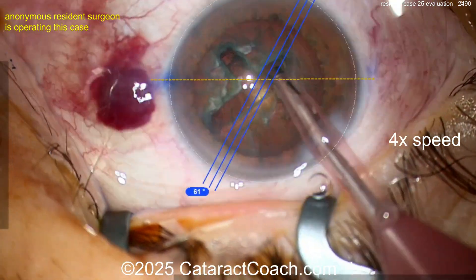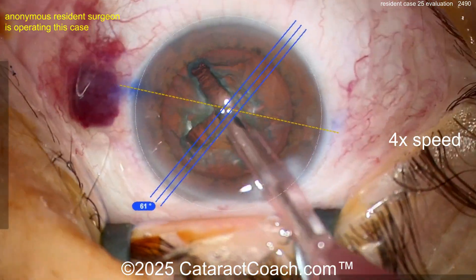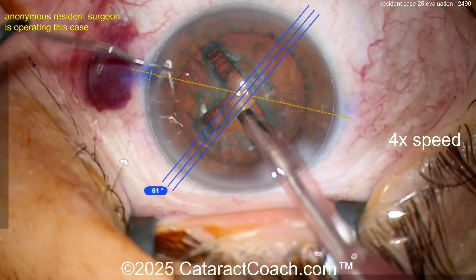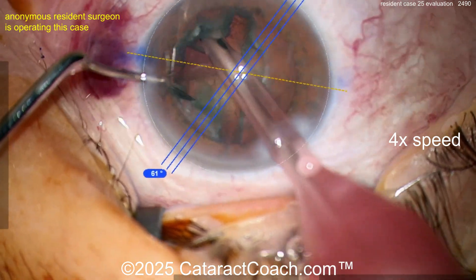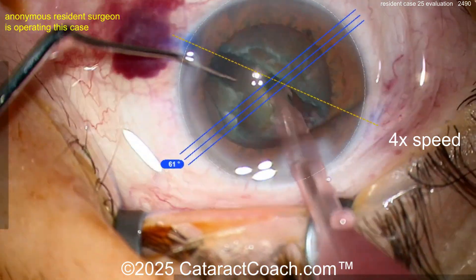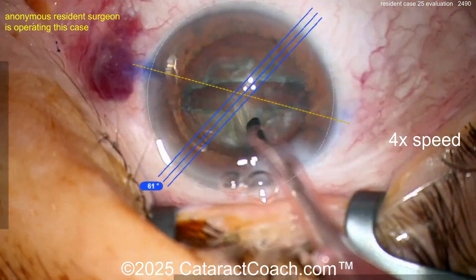The video is sped up because cataract coach fans don't want to sit through a 25-minute video. Now we're going in with the second hand — let's see what we're doing here, splitting the nucleus. That's pretty good. You've got really good skills for 25 cases in. You've obviously practiced a lot.